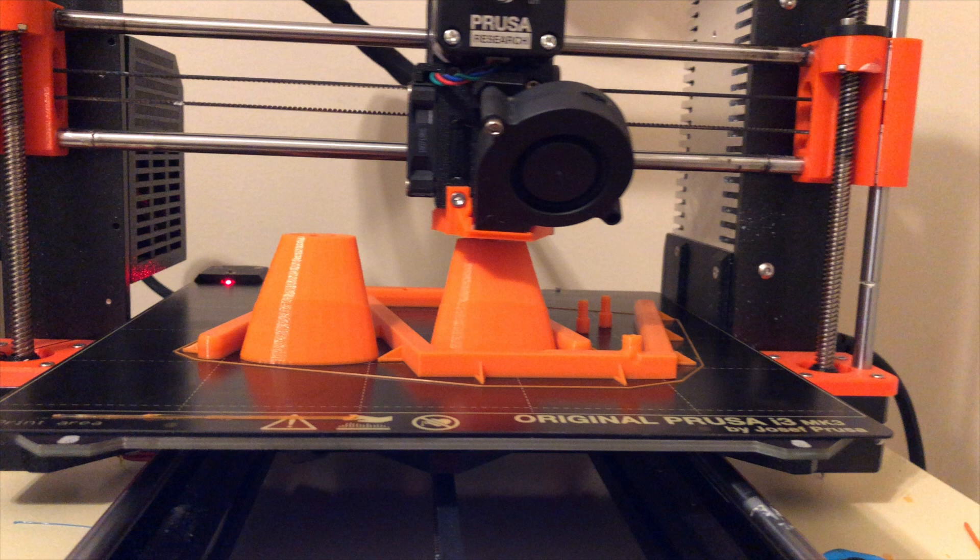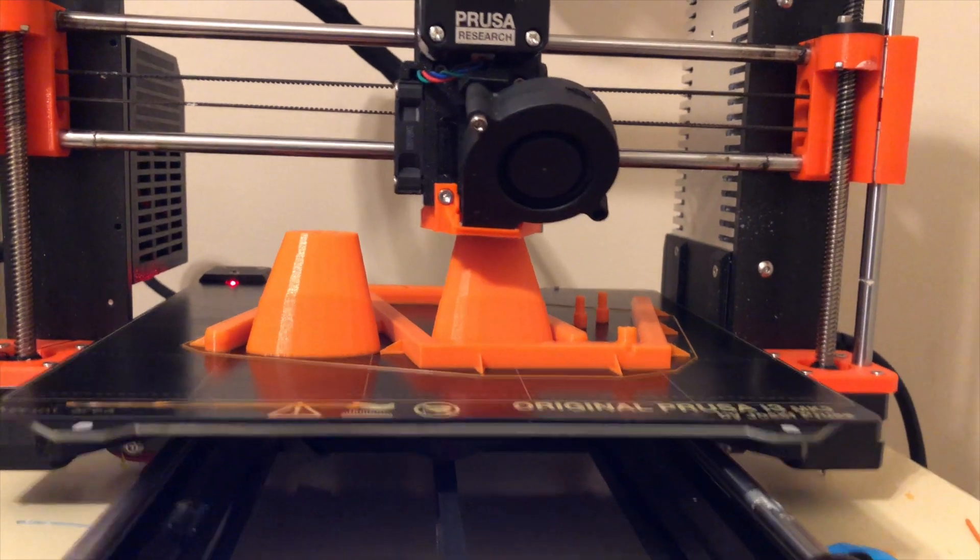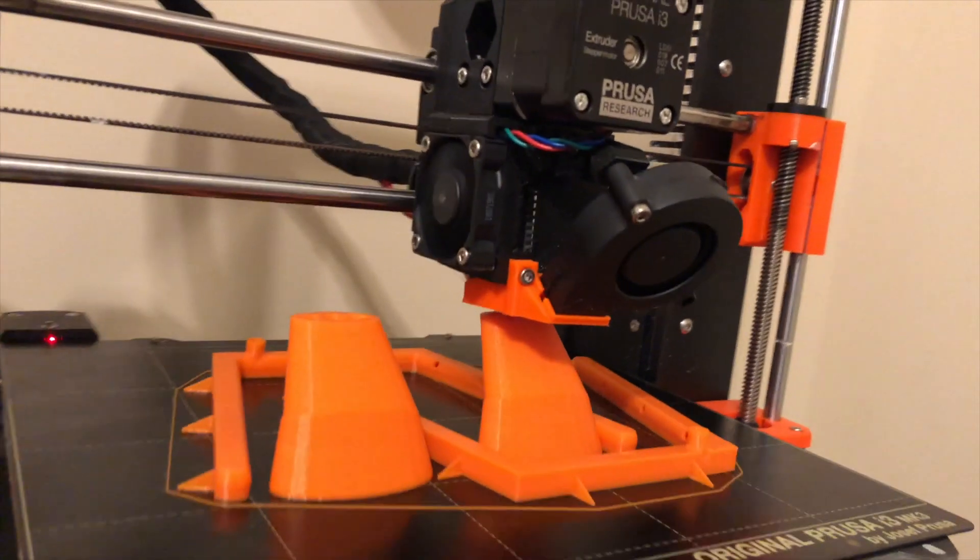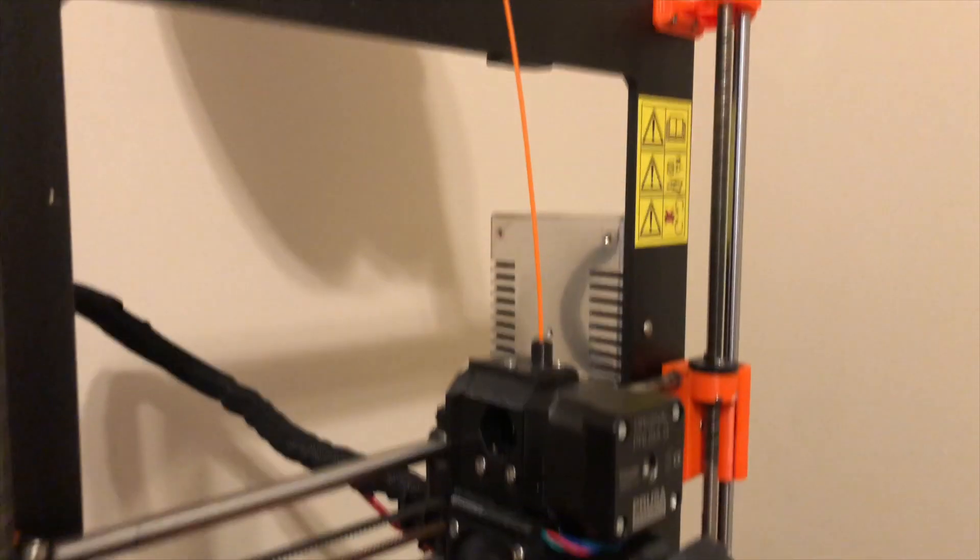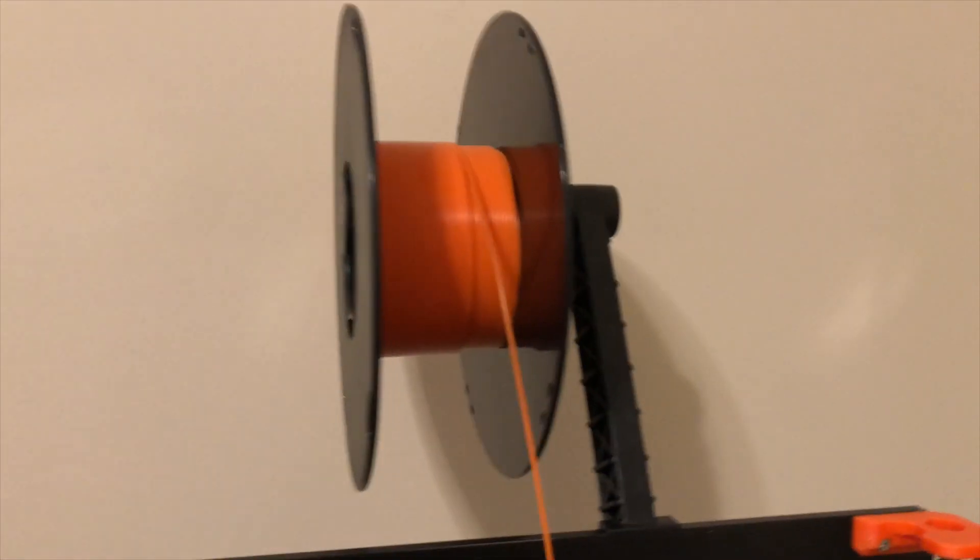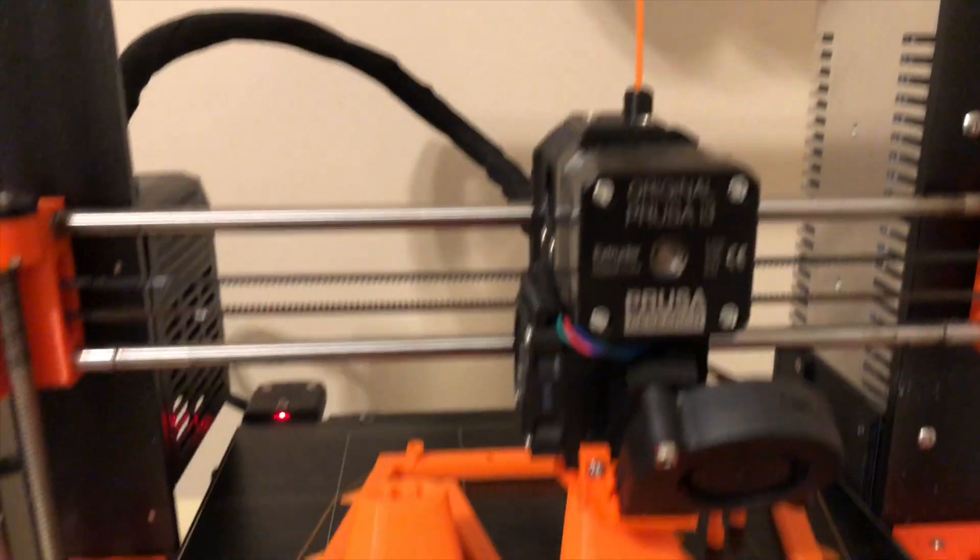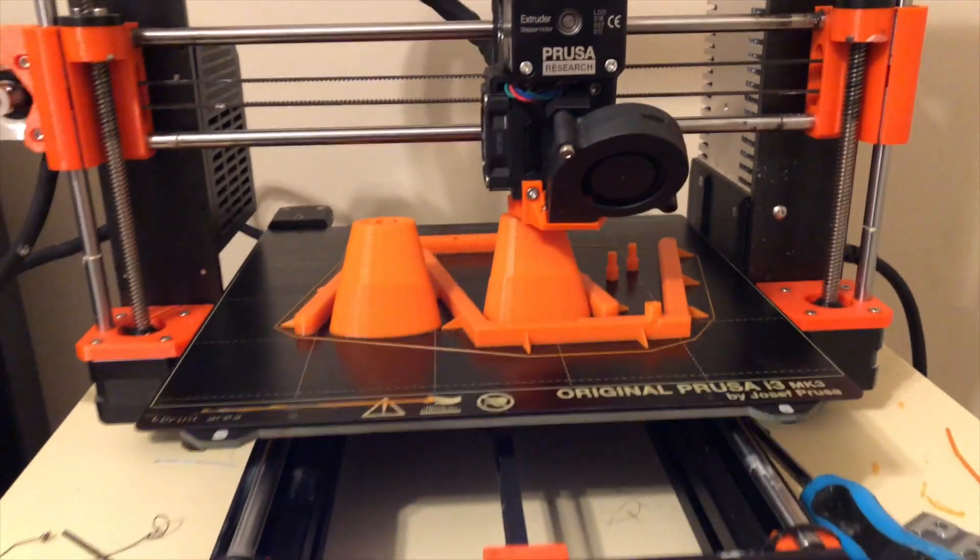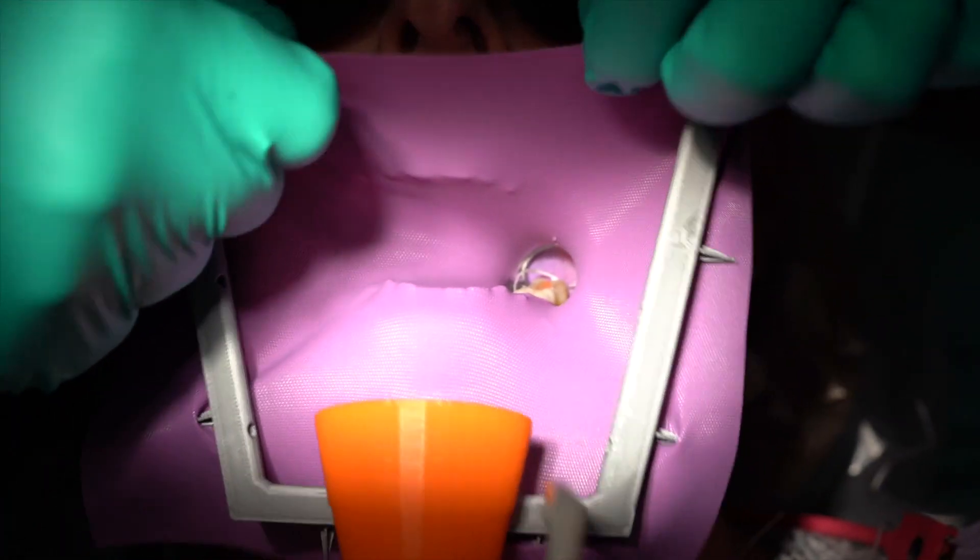There's lots of biocompatible plastics. They can be disinfected. And basically fused deposition modeling is like a giant glue gun. It uses a spool of plastic, in this case polylactic acid, which is a plant-based plastic, and it heats it up and squirts it out in tiny little layers. So it's really fun stuff, guys. If you're wondering how you get these made, that's what you do.